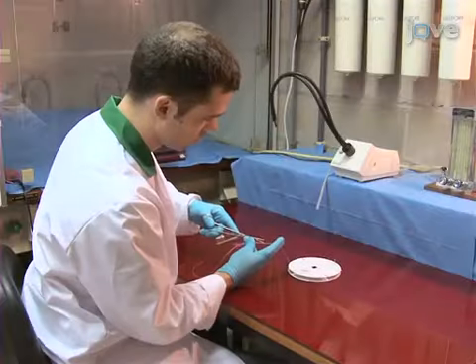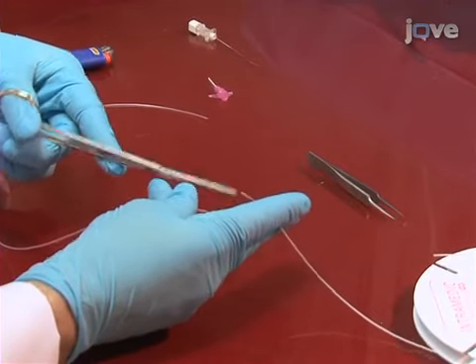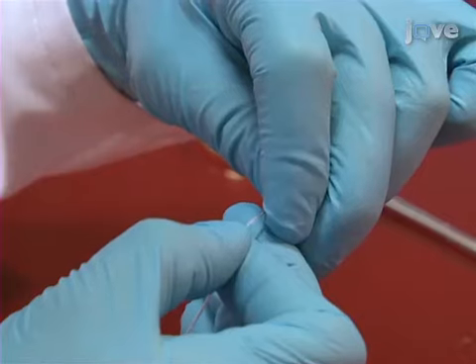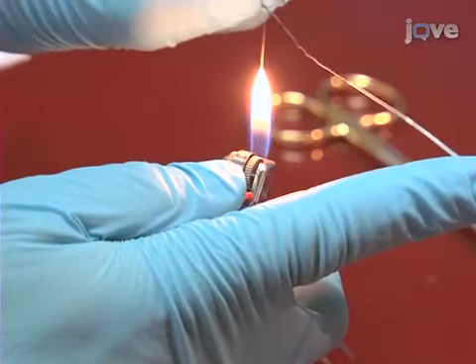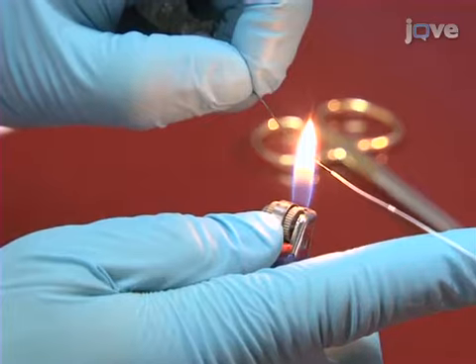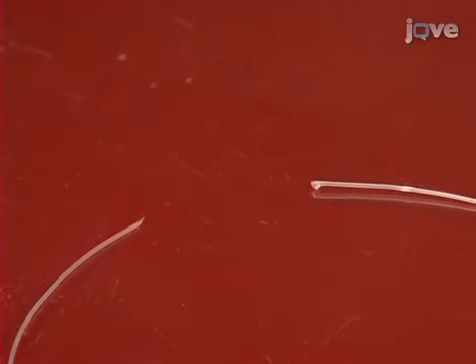To prepare the tube you want to implant in the bladder, first cut a PE50 tube at the desired length and put a small white piece of 18-gauge catheter over the main catheter. Then, create a small cuff at the end by flaming one end of the tube and flush it with saline to void any air.